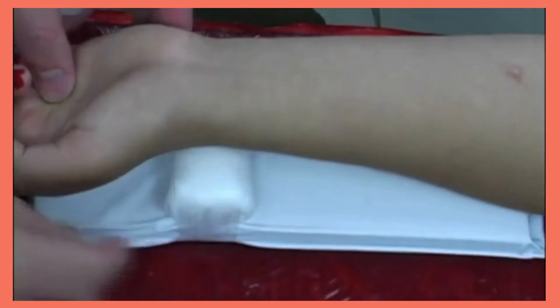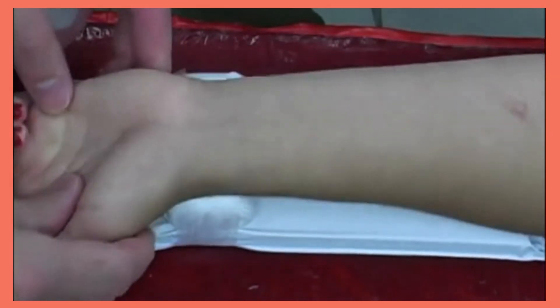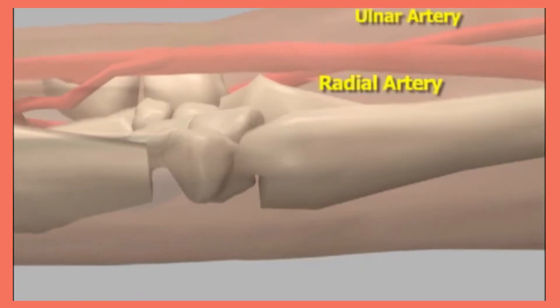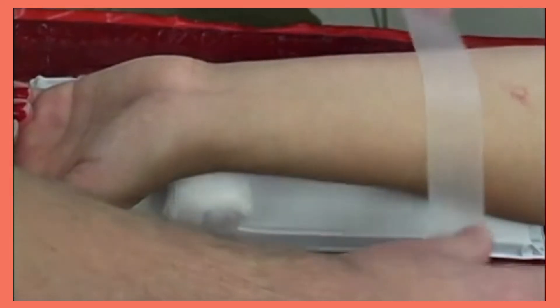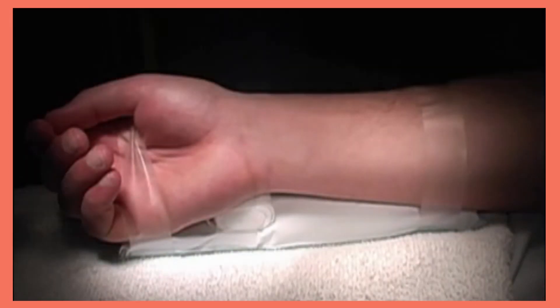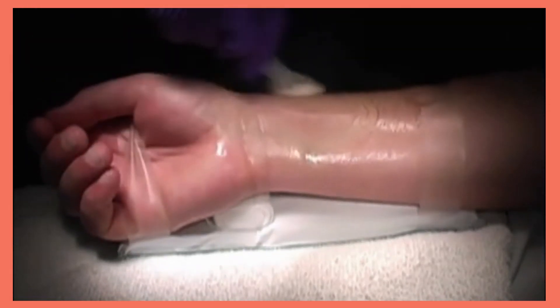Prior to sterile field preparation, position the wrist. By positioning the wrist in dorsiflexion, the radial artery is brought into closer approximation to the skin, which can be instrumental to the success of the procedure. Proper positioning can be maintained by placing a roll of gauze under the wrist or by using a specially designed arm board and securing the arm with tape.